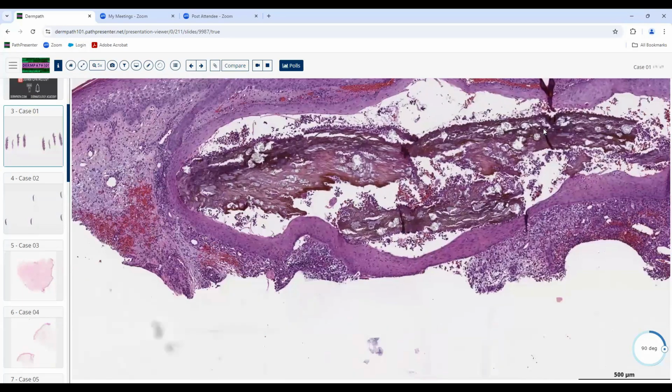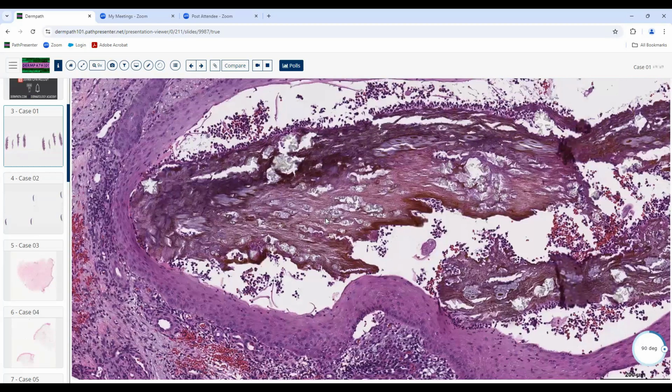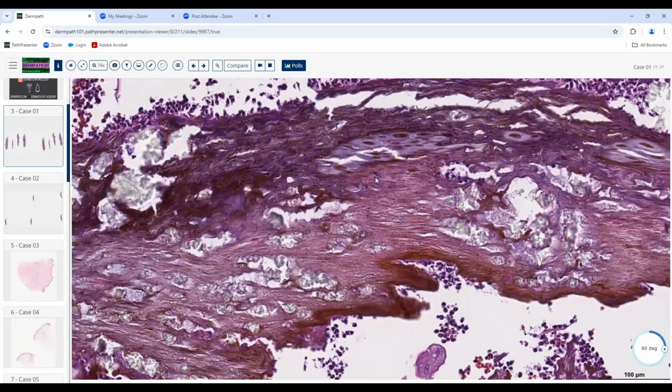And if you look at higher magnification, it's got these little individual cells in here. So this is a foreign body, and it's a splinter. Now, I don't know what kind of splinter it is. It could be from a rose thorn, could just be a piece of wood. Maybe the patient was working out in the tool shed or something like that and got a piece of wood in their hand, or maybe they were walking on the staircase and a little splinter came off of the railing and got them. But this is a classic example of a splinter. It's pretty easy, so you really wouldn't have too much difficulty making this diagnosis.